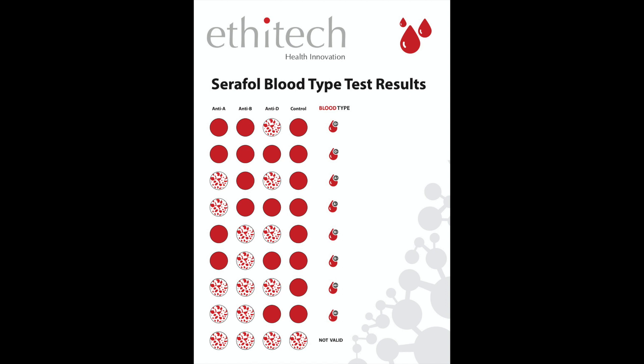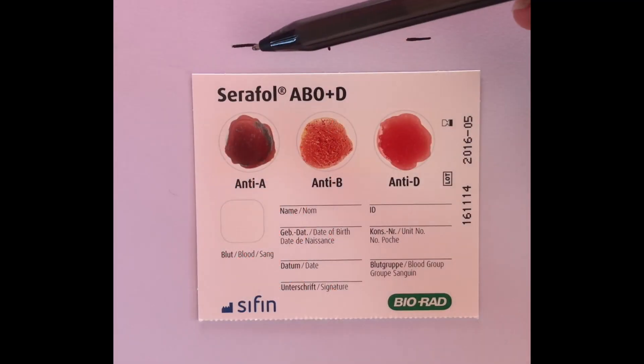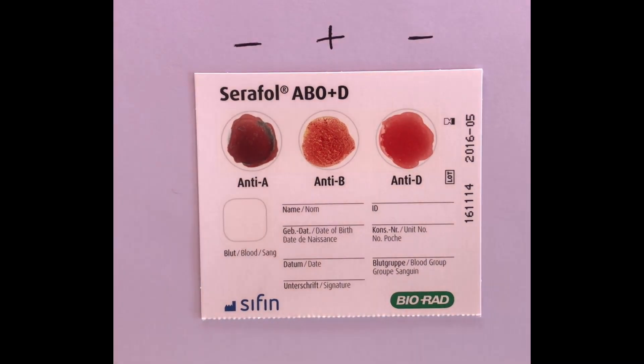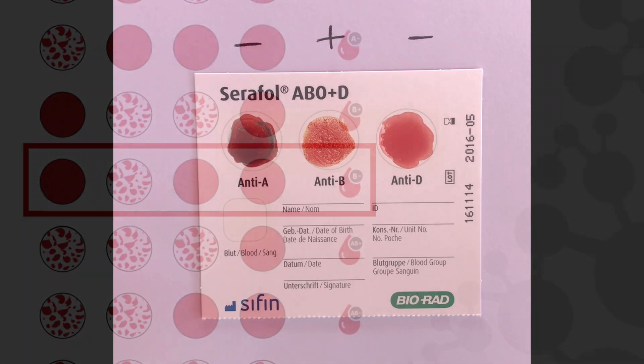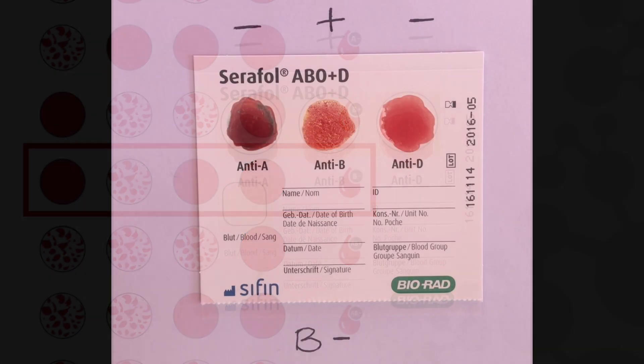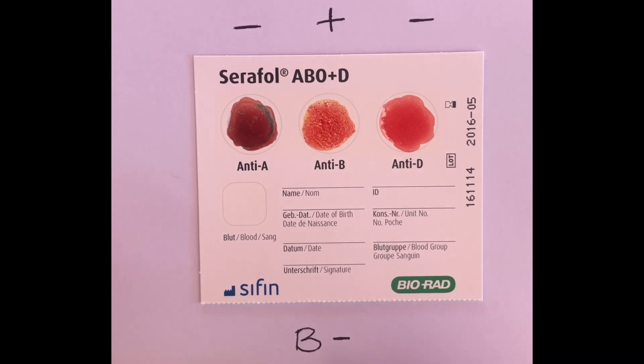The third reaction field gives us the positive or negative result of the blood type. In this case, we had a negative reaction in field A, a positive reaction in field B, and a negative reaction in field D. With a positive agglutination in field B and a negative agglutination in field D, the blood type result is B negative.